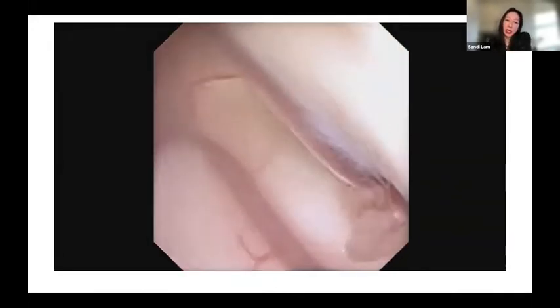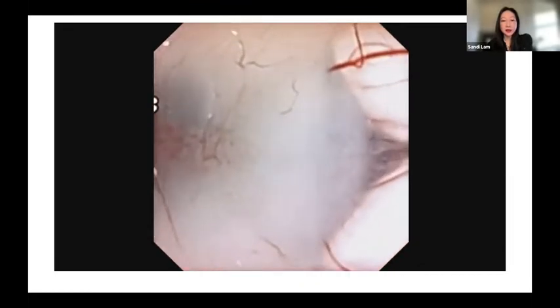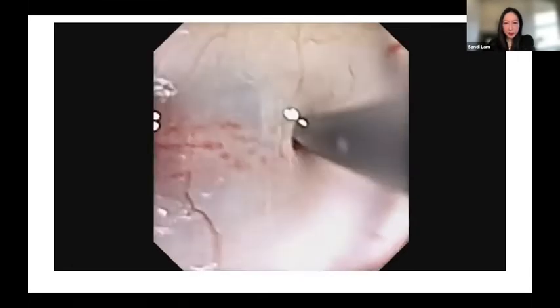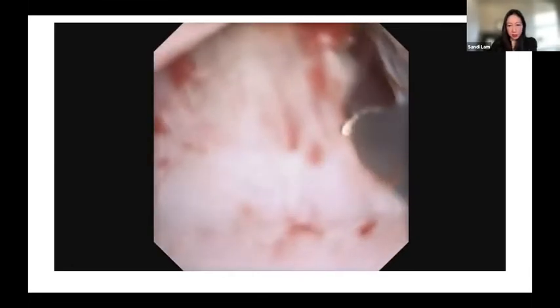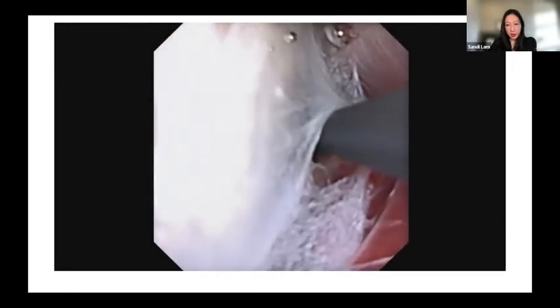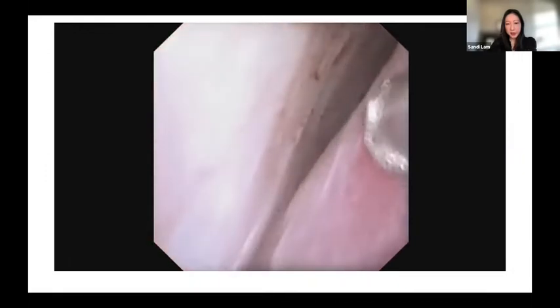But here, you'll see that when I looked inside to do the endoscopic third ventriculostomy, I found quite a dilated aqueduct. So here is the floor of the third ventricle, and then we did the ETV here, using the same technique to be able to see that naked basilar artery and definitely not having the bovie be connected to power.